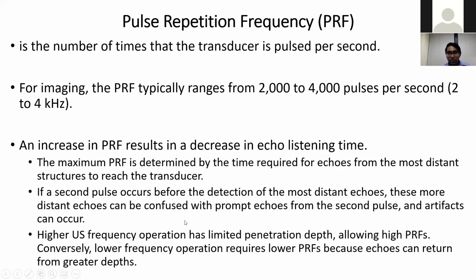So I would also mention that high ultrasound frequency has limited penetration depth, because as you increase the frequency, the attenuation also increases. So the amount of energy absorbed by the medium is much higher, and thus allowing only to look at limited depths, but that allows us for a higher PRF. And higher PRF also translates to higher frame rate.